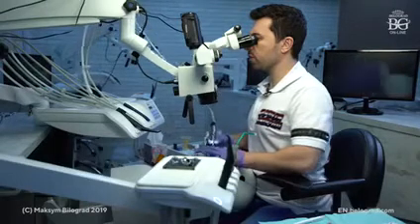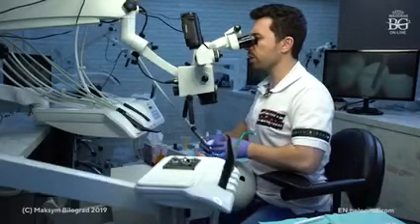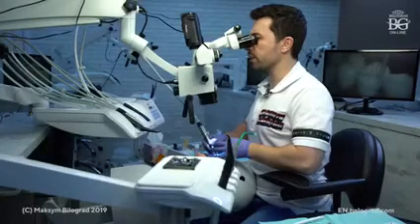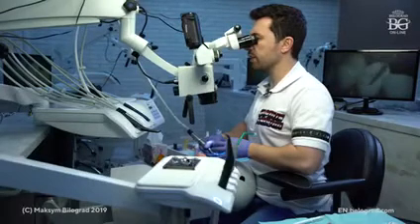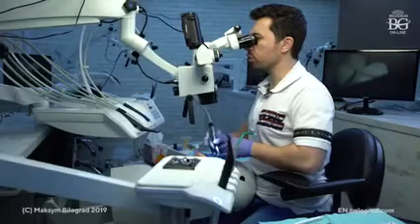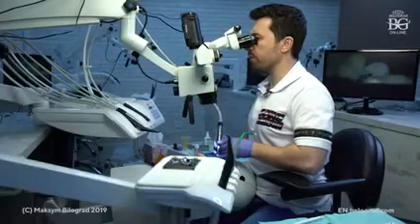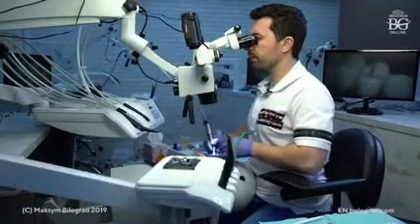Okay, and see, the transition here is really super sharp. It has to be super smooth, not super sharp. Otherwise, you may expect cracks and problems with the ceramic restoration. So that has to be really smooth. Smooth and rounded. This is important.